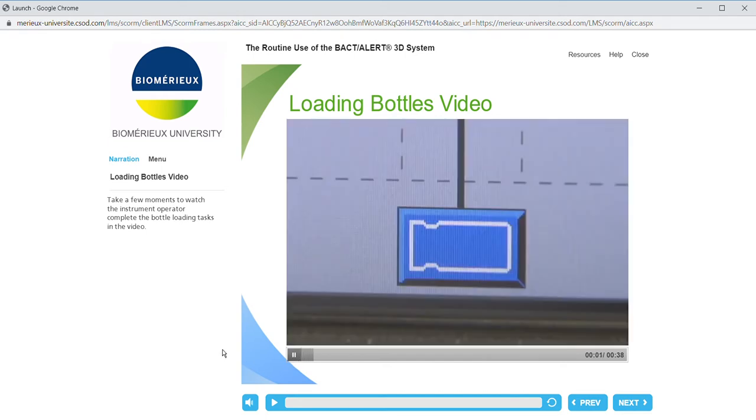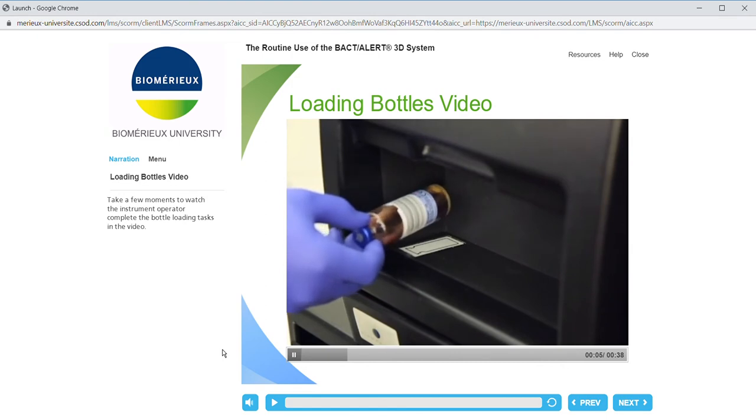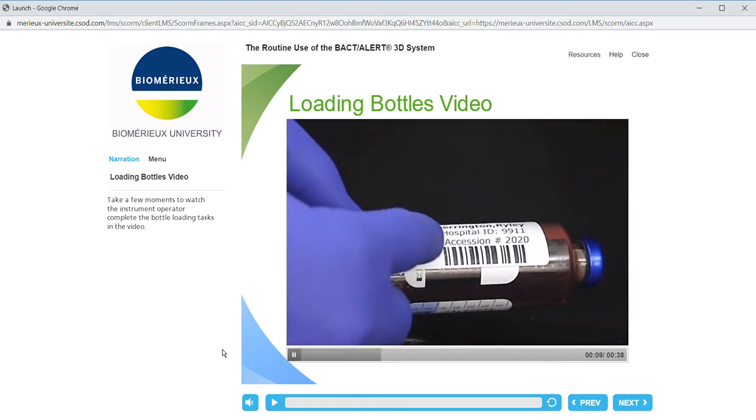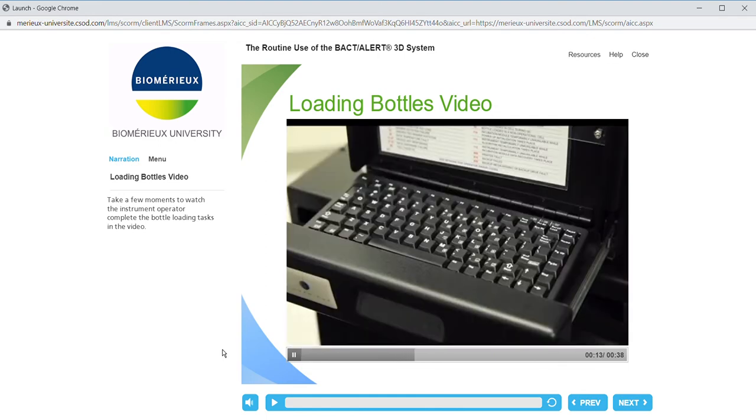Press the load bottle button. Scan bottle ID. Scan the accession number. Note: you may also use the keyboard and type the accession number.